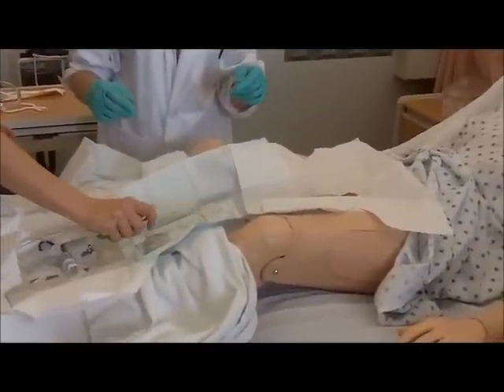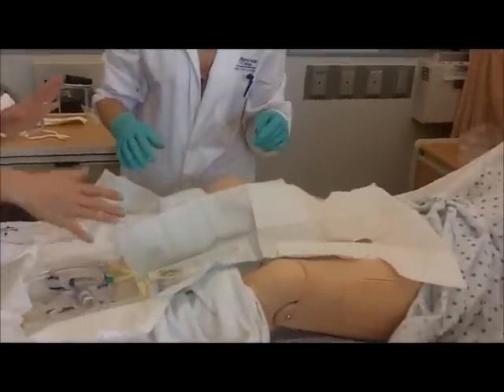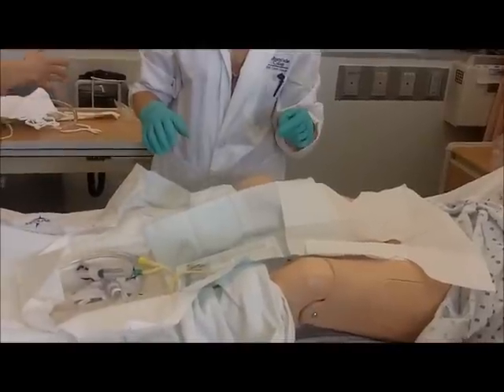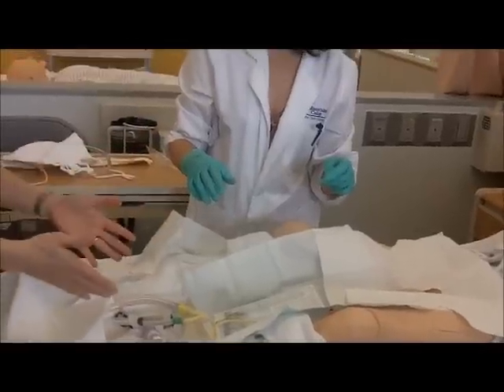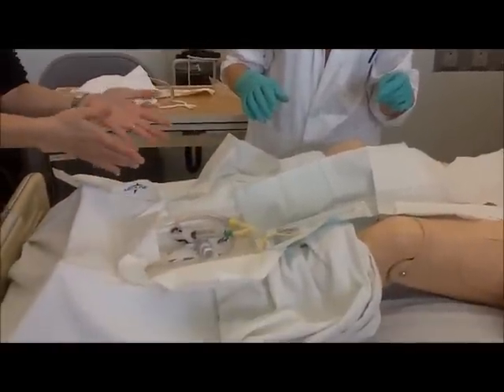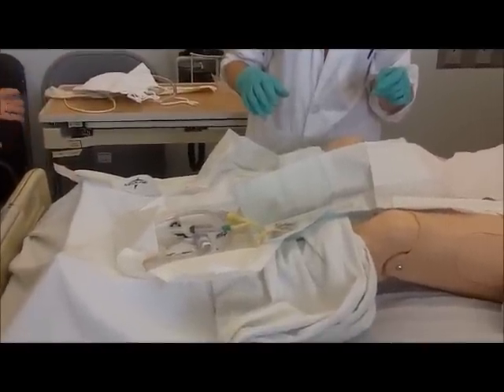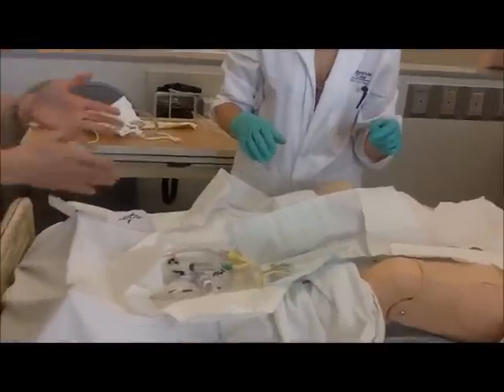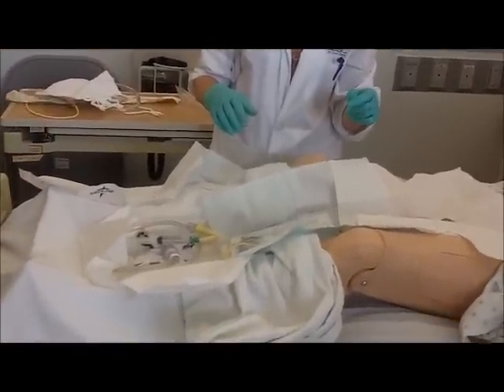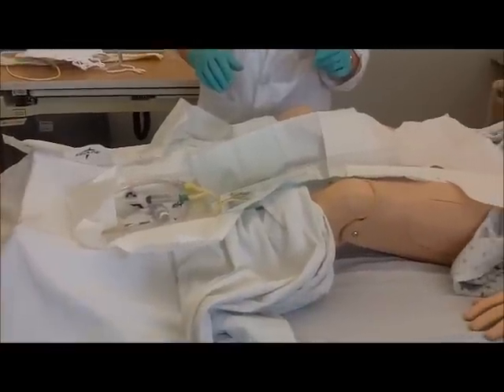You can put that tubing in here — this is all here, so you can just kind of... That's why I work right here. I don't work over there because I have to move from here to move here. This way I put everything here. But then it takes some effort sometimes because I may have to clean the patient's room — sometimes patients' rooms are a mess, their bed is a mess. I may have to take linen off. So I create a nice clean area that I'm working on over here.